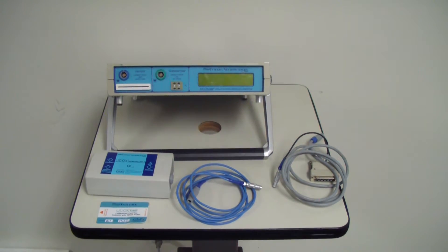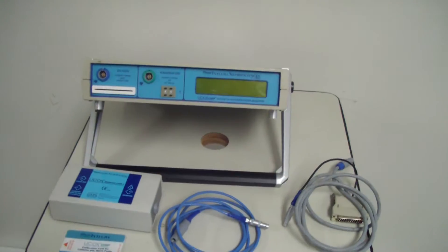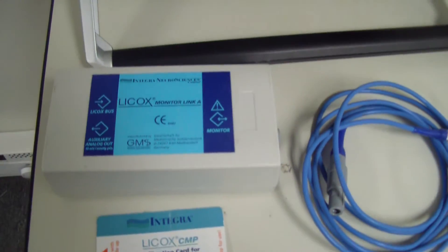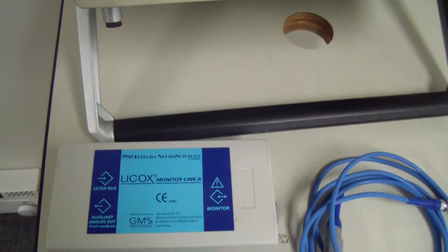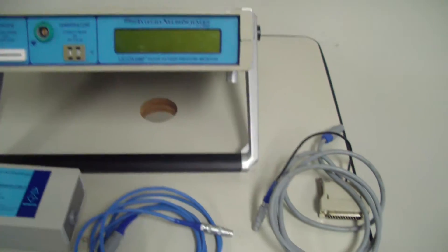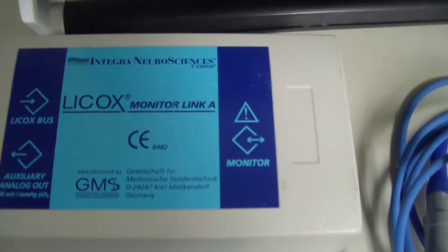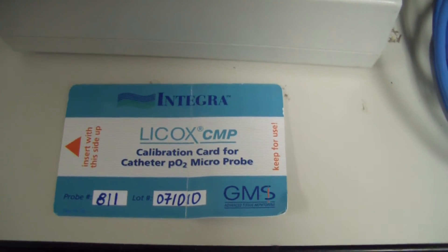It's DCSP Medic. We're looking at an Integra Neuroscience little oxygen monitor. It has some cables with it, a control module, as well as a calibration card.